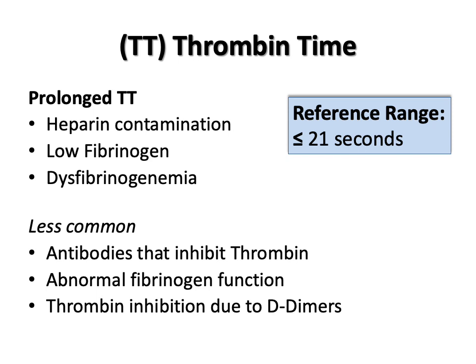The thrombin time is often performed along with the APTT as part of a mixing study. It may also be performed to determine if heparin is present when the APTT is prolonged. Thrombin time may be prolonged in cases of hypofibrinogenemia, with fibrinogen levels under 100 milligrams per deciliter, and dysfibrinogenemia.